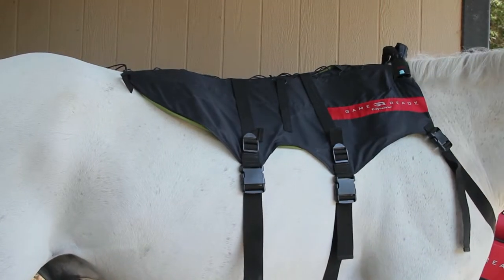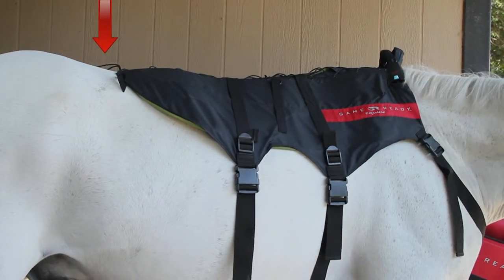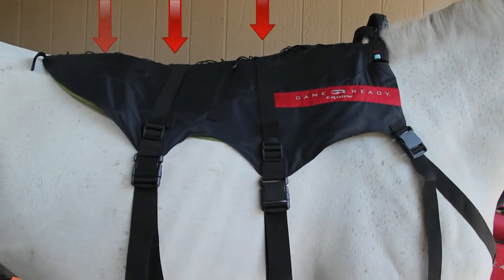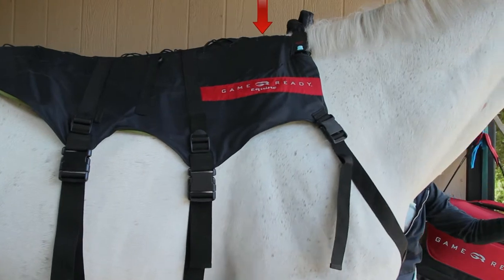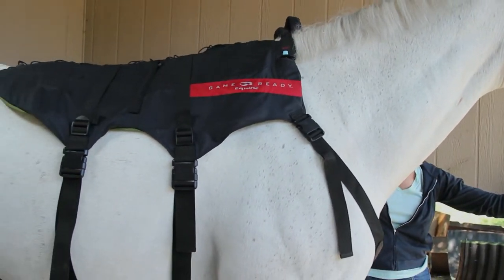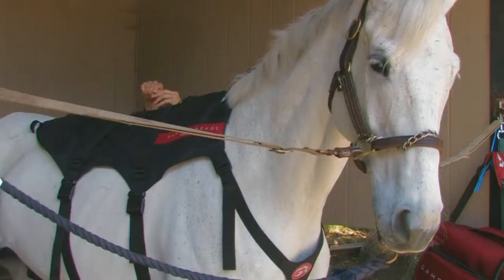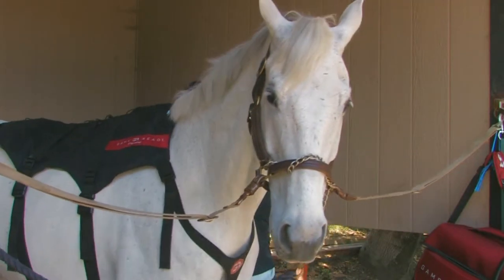Step 4. Use the lacing along the spine of the backwrap to customise its shape for optimal fit and contact. For best contact, adjust each side of the backwrap to cover the horse's spine. The right and left sides of the wrap may overlap slightly, but should not be folded over onto themselves.